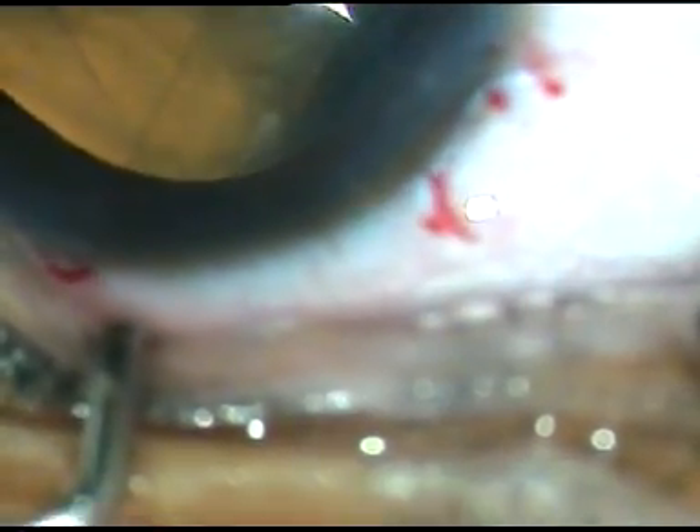Injecting viscoelastic substance and then coming out. Now I enlarge the main wound a little bit to about 3 mm, because I am going to implant a multi-piece intraocular lens and I don't want to stretch the wound.